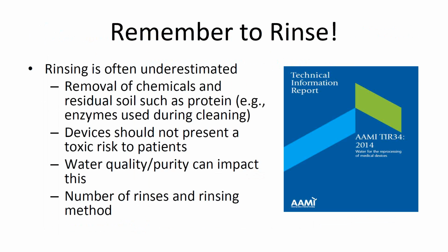So now that we've completed manual cleaning by brushing and flushing the forceps elevator in your duodenoscope and your normal channels in your regular endoscopes, we've now moved on to rinsing. So rinsing has to occur after the manual cleaning to remove the chemical or detergent that's been used for the cleaning process and any debris that's been loosened during brushing of manual cleaning.